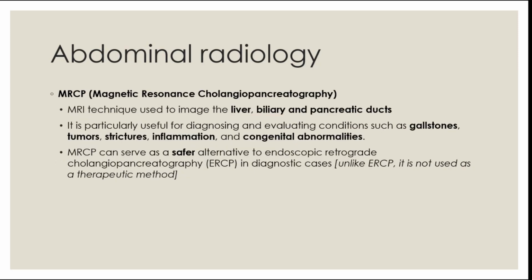MRCP, magnetic resonance cholangiopancreatography. You have an image for this in the pictures, and it's important to know that it's for evaluating or interpreting some findings in the liver, the biliary tract, and the pancreas. You can evaluate conditions like gallstones, tumors, strictures, inflammations, or congenital abnormalities.